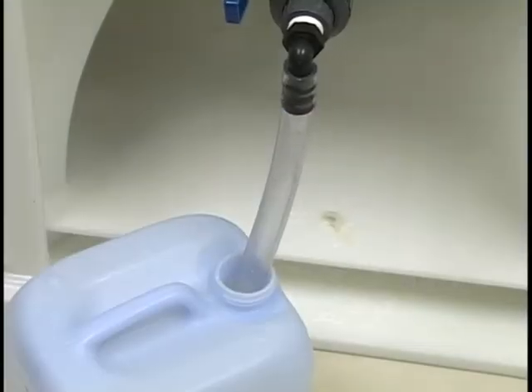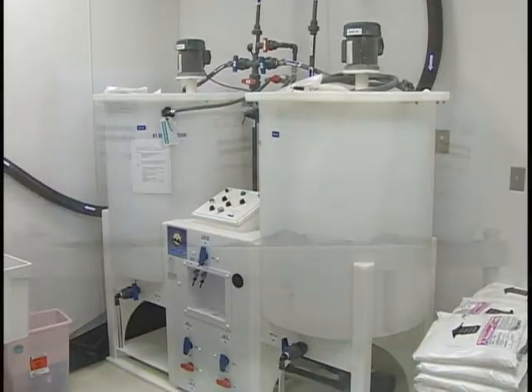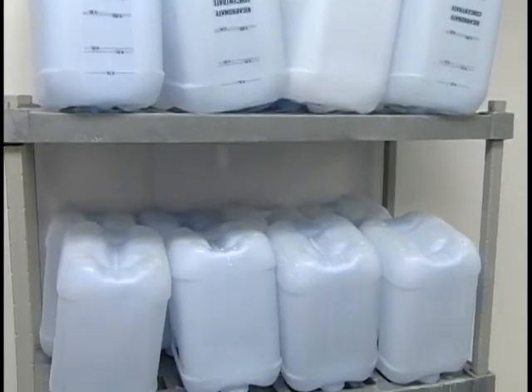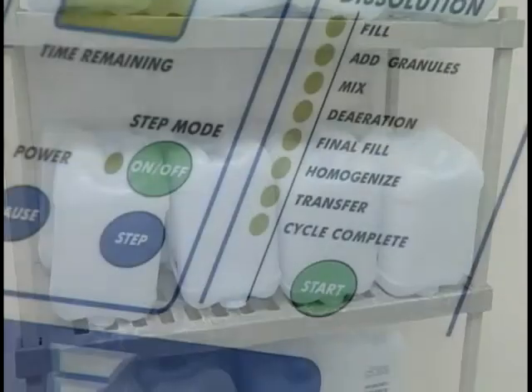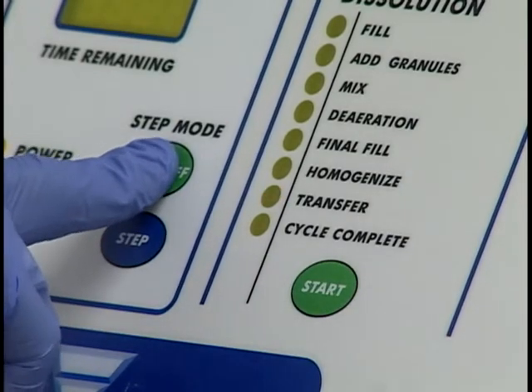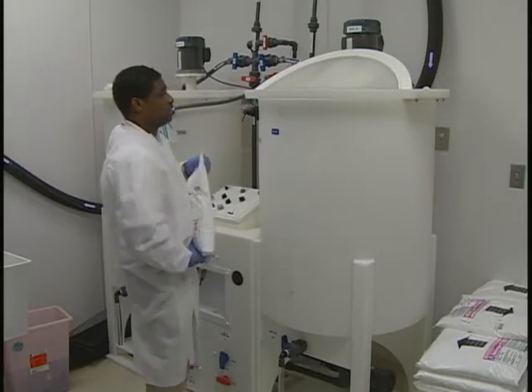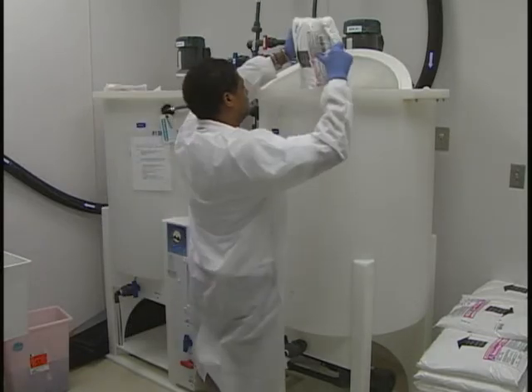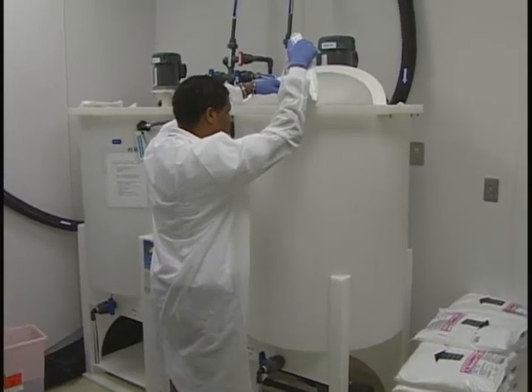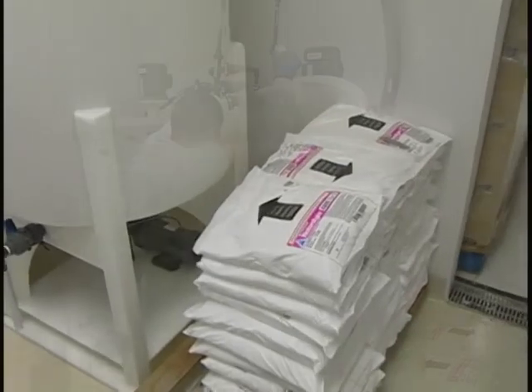Dialysis centers have the option of preparing these concentrates by batch using a mixing machine, or they may prepare smaller quantities using mixing jugs. No matter which method is used to prepare the concentrate, the sodium bicarbonate concentration is unstable and highly susceptible to bacterial contamination. Once prepared, the facility must use the entire batch of bicarbonate within the manufacturer's prescribed time limits.